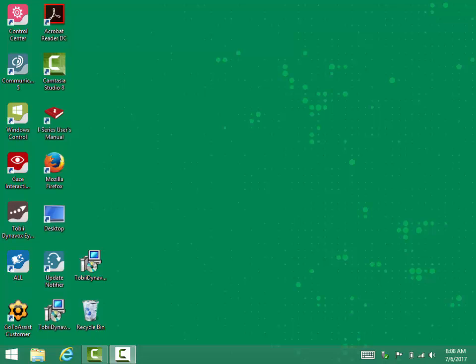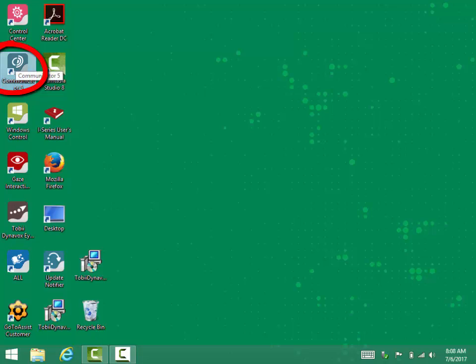To open the communication software for the user, you'll identify and locate the Communicator 5 icon on the desktop. On this particular device, it's located on the left-hand side, but keep in mind that it might be in various locations on different devices.